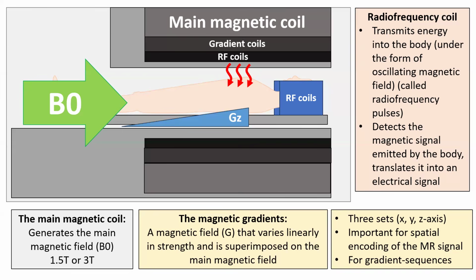In this part of the examination, also notice that I've drawn two coils. One is built into the MRI machine, another one is basically a coil that can be put over the head, and we have other types of coils that can be used for body imaging or musculoskeletal imaging. So we can use coils that are located in the machine, or we can use coils that are put over specific body parts, like a head coil in neuroradiology. And we have coils that are just transmitting, coils that are just receiving, and coils that can do both things.